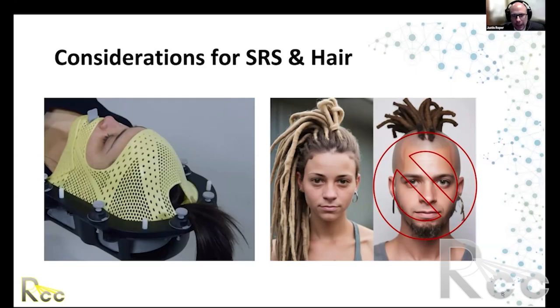Okay, so another consideration with brain treatments, whether it be radiosurgery or partial brain, is the patient's hair. Now, patients who have more hair, unlike me, are more challenging to set up and to do so reproducibly. So care really needs to be taken to position that hair consistently at simulation such that it's out of the way and then day-to-day on treatment.